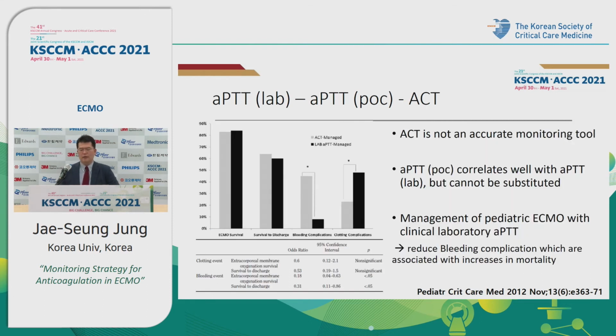ACT is not an accurate monitoring tool for heparin management in pediatric ECMO. The POC APTT correlated well with the clinical laboratory APTT, but cannot be substituted for the clinical laboratory APTT value. Management of pediatric ECMO with the clinical laboratory APTT can reduce bleeding complications, which are associated with increased mortality.